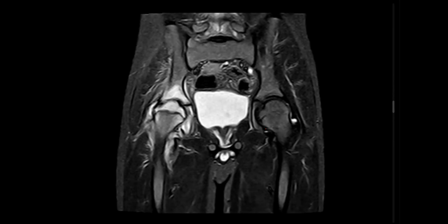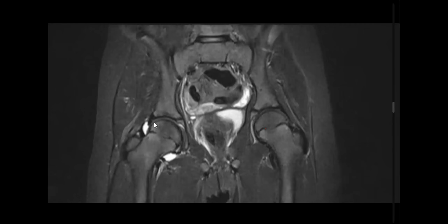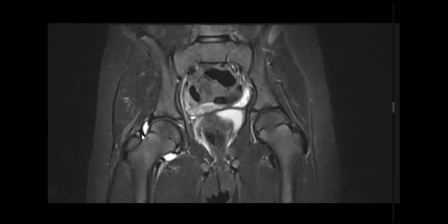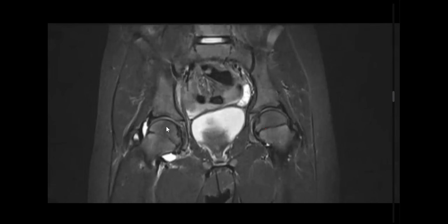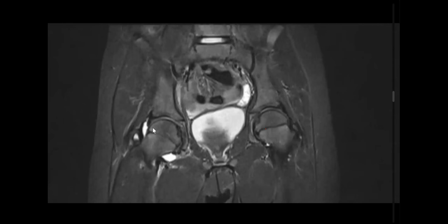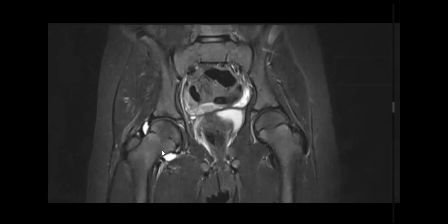Okay, so concentrate, my friends. This is a case of transient synovitis, and this is a case of septic arthritis. In transient synovitis, both sides of the joint are normal. The femoral head is normal. This is a STIR, a fat-suppressed image. There is no edema, the acetabulum is normal, and there is no narrowing and no irregularity in the cortex on both sides. Just simple joint effusion. It's transient synovitis.